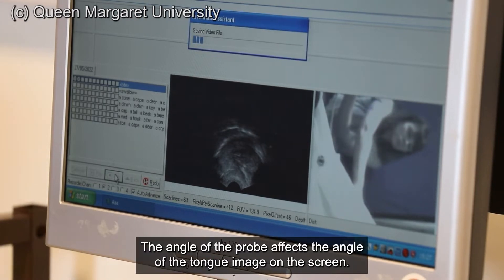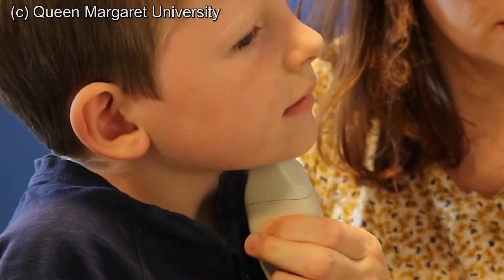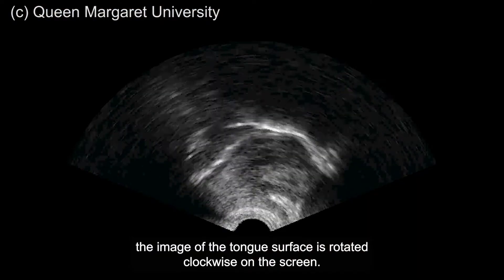The angle of the probe affects the angle of the tongue image on the screen. The further the probe is angled towards the throat, the further the image of the tongue's surface is rotated clockwise on the screen.